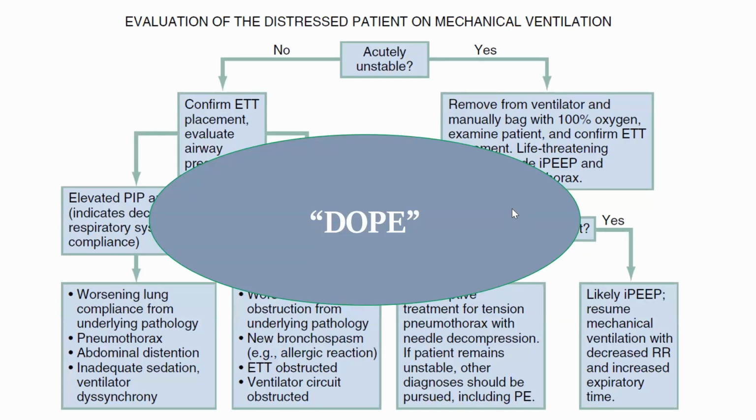One last question. Is it important to set PEEP in addition to auto PEEP? Yes, it's important. That was what I was talking about. Auto PEEP means the patient is generating PEEP in addition to the set PEEP. If you apply a PEEP of 5, for example, and do an expiratory hold maneuver, just like the inspiratory one, you can see the total PEEP. If PEEP was 5, and at the end of the expiratory hold the total PEEP you are seeing is, for example, 10, that means the patient has an auto PEEP of 5. The 5 does not come from anywhere else. It comes from the patient's dynamic hyperinflation.